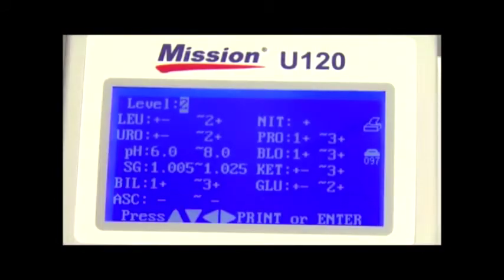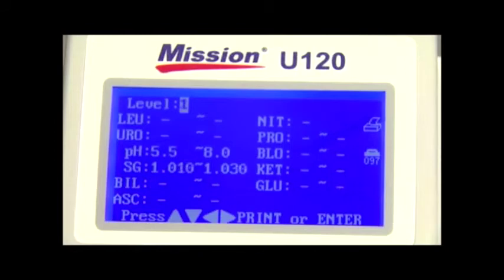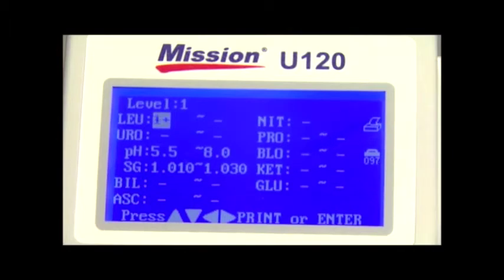Press up or down arrow to change the highlighted digit. Press left or right arrow to move to the digit to be changed and press up or down arrow to increase or decrease the value. Change each of the analyte QC values in this manner until the desired values according to the inserts are shown.